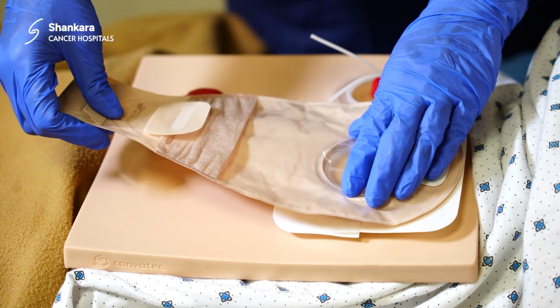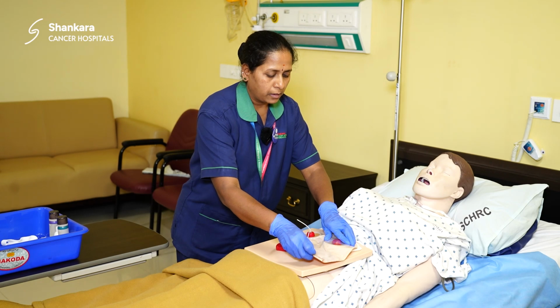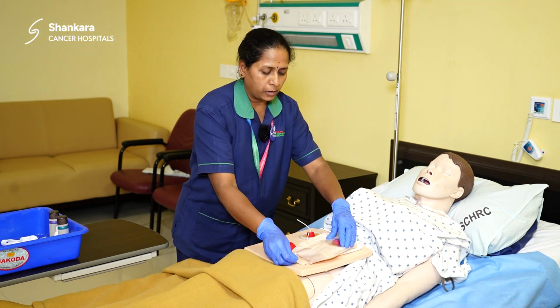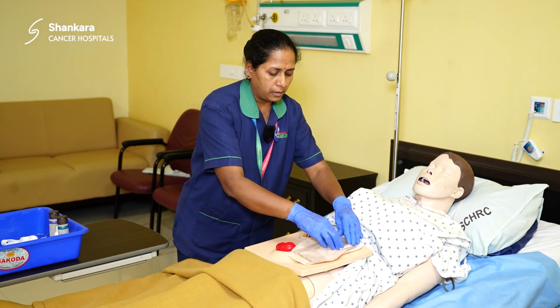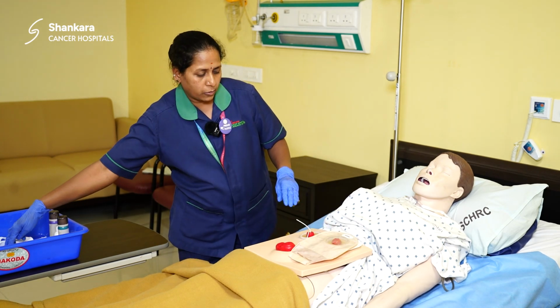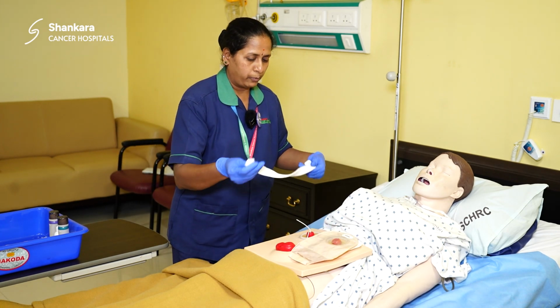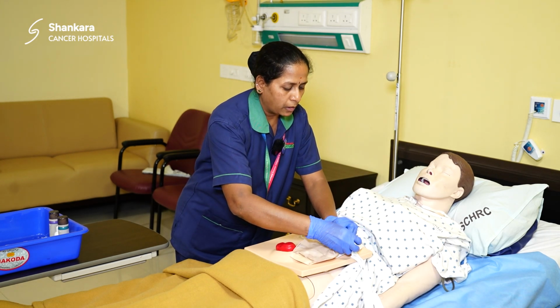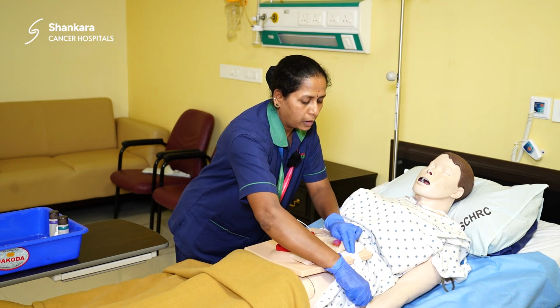Some people like to keep their bag to the side of the patient, or they want to keep it straight. We can fix the bag straight, then secure it with a belt so that it will sit properly and the patient will have confidence that it will not leak.